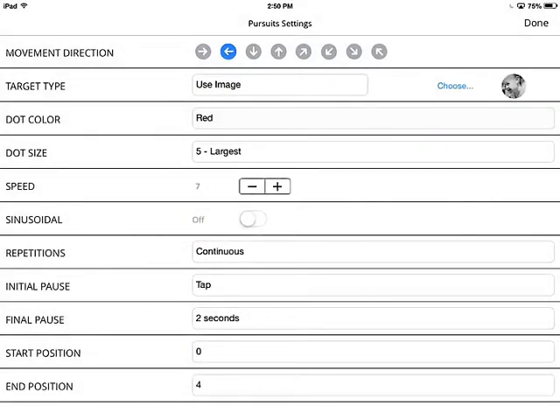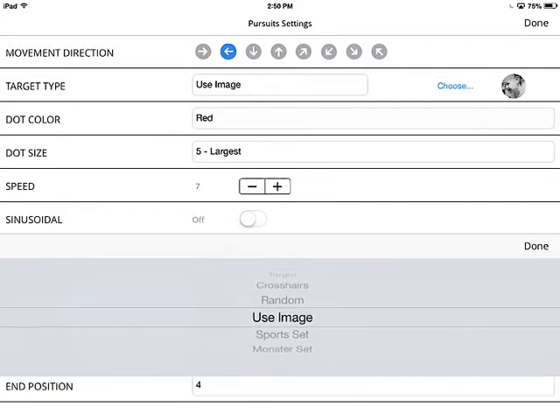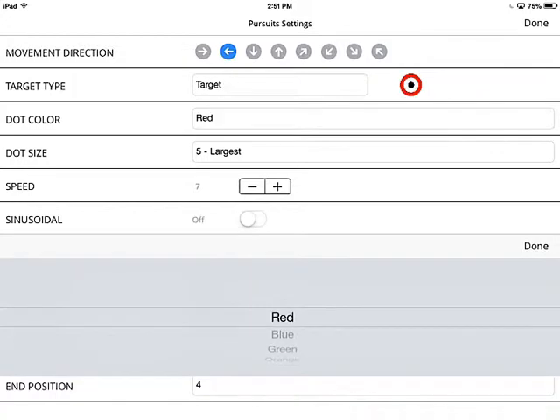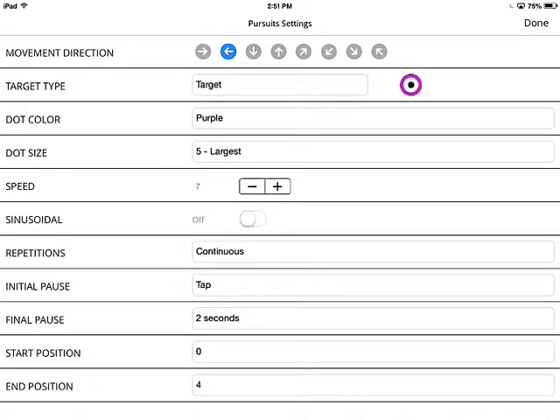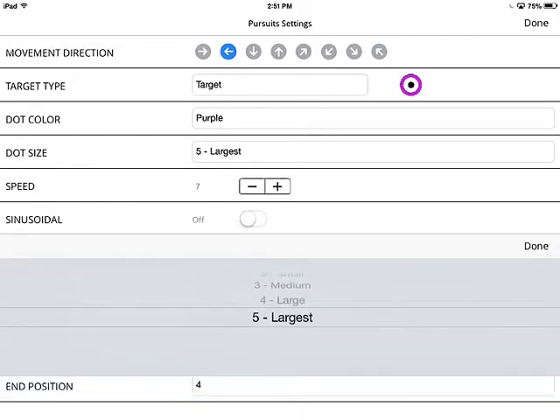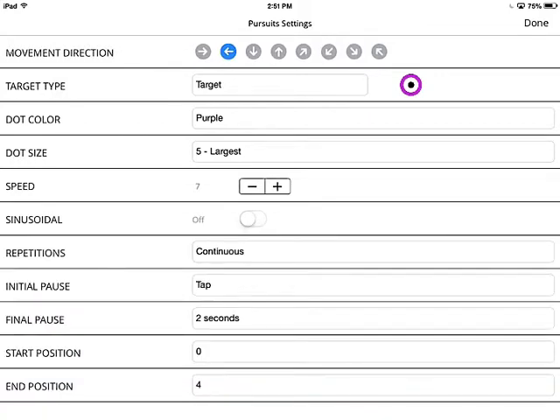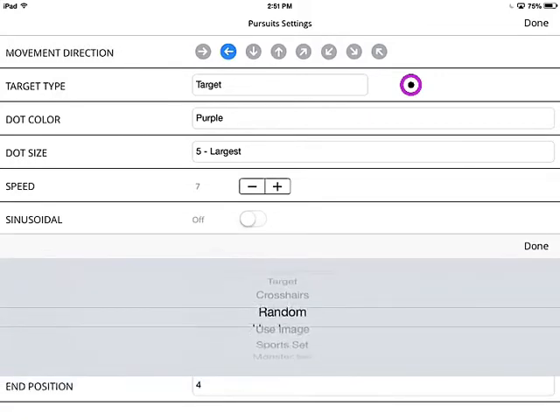We can also select the color. With the image selected, the color won't apply. But if I pick the target and want to change the color, I could change it to purple — if I like purple, or if purple has a better effect on my patient. We can also change the size. I'm going to leave it on the largest size and change the target to the sports set.